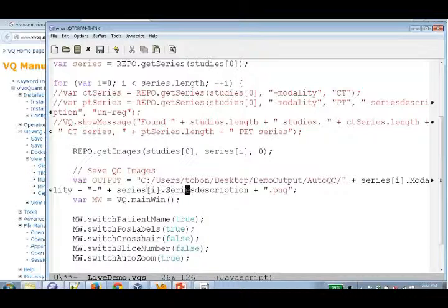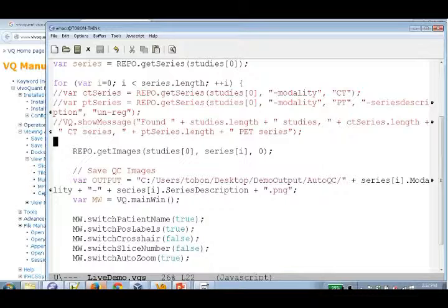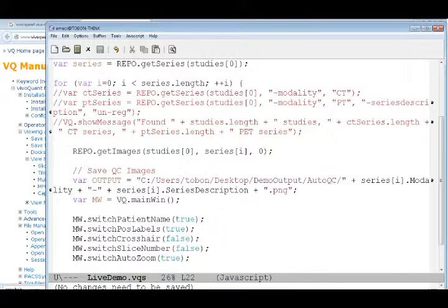Lovely programming details. It's just capitalization. As a last form of resort, which you should not hesitate to use, please feel free to contact support at inviCRO. If you're looking for a function, it's not explained well enough in the documentation or whatnot, we can field some of these questions that are more advanced.